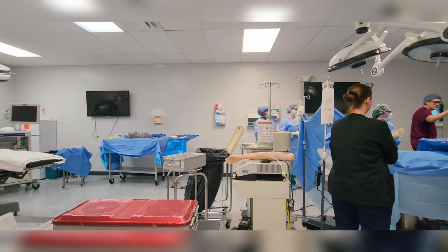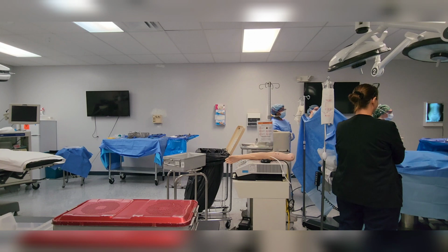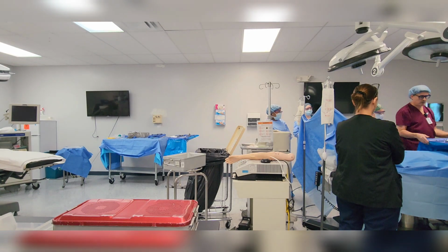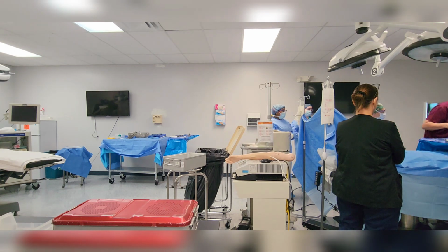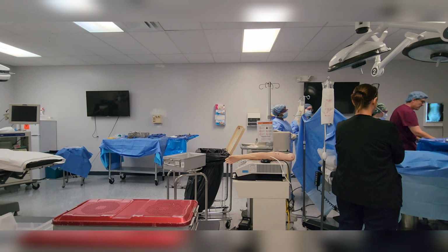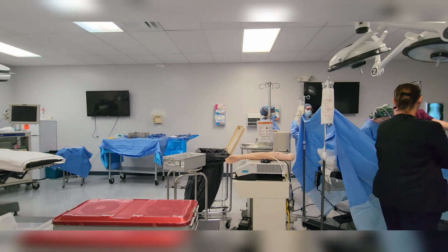So the only thing I don't see is light handles. Now, obviously this needs a little work, but I'm just curious, because I was never trained, why is this here? It's supposed to be a little bit more. So I always think about like an L situation. So this is yours, right? And let's say the doctor was going to be on that side, and you're going to be here. Is this comfortable passing the doctor? Yeah. So just think about it. You would have to go like this. So to me, I would put my tray just kind of like this, where I can still go like this, right? Now, would you think this needs to be over here? So those are things I start thinking about.